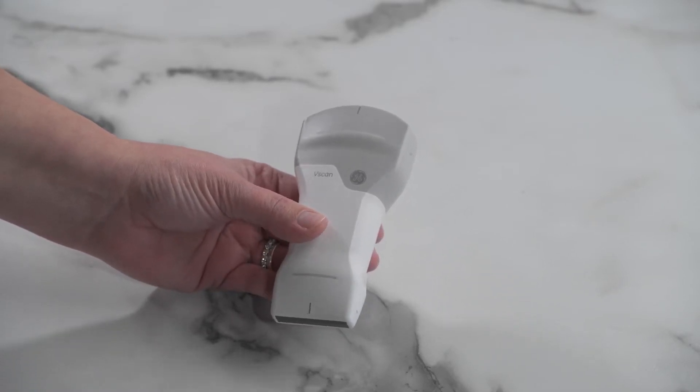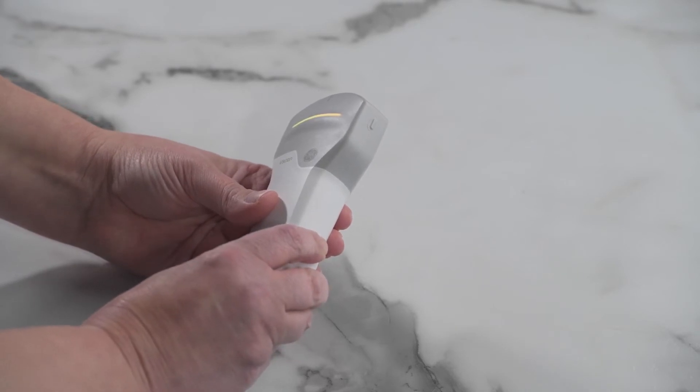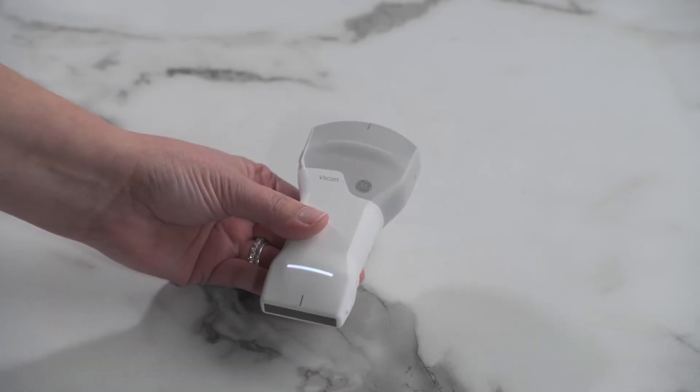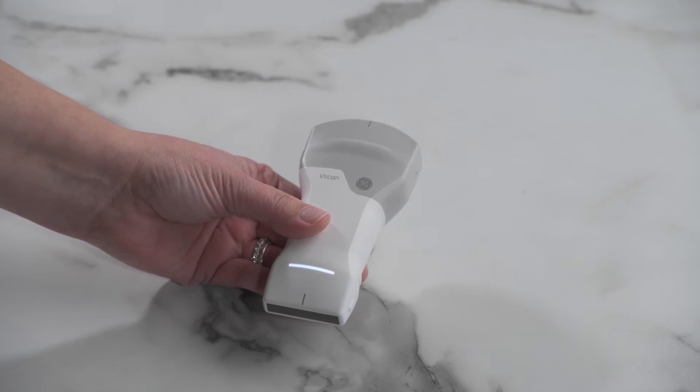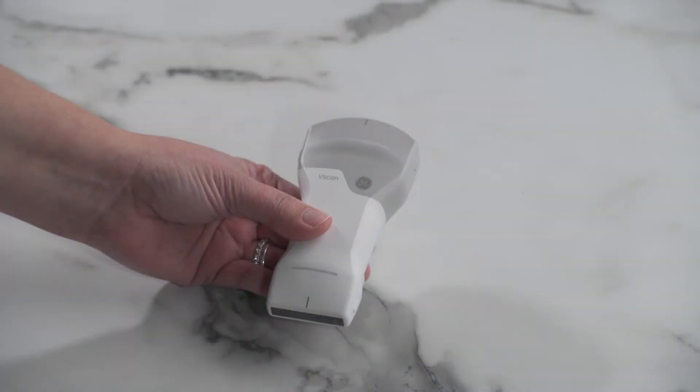To connect the vScan Air Probe and the vScan Air App, turn on your vScan Air Probe. A blinking white light alternating between the two ends indicates that the probe is booting up. Now open the vScan Air App. The LED light now turns to a blinking white on both ends to indicate that the probe is on and searching for the app.